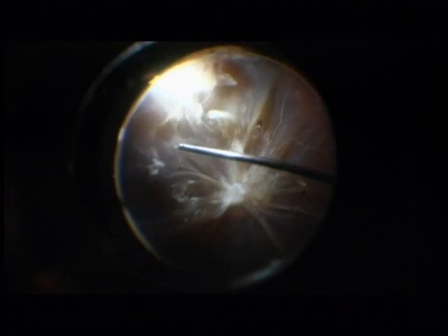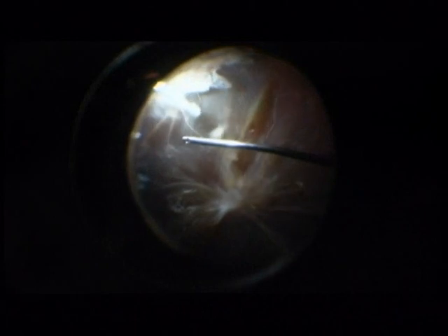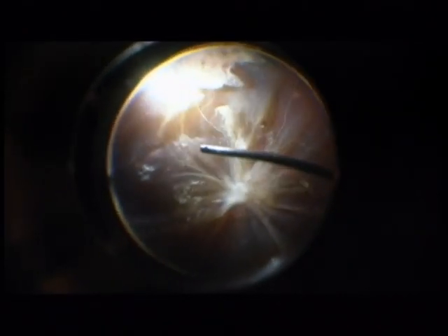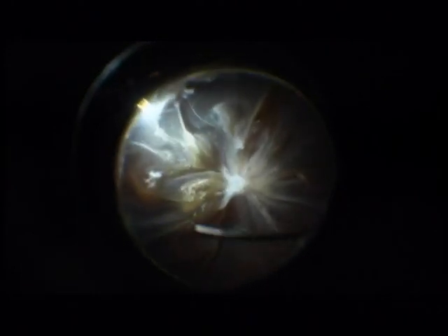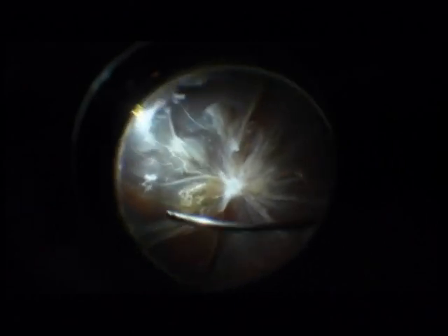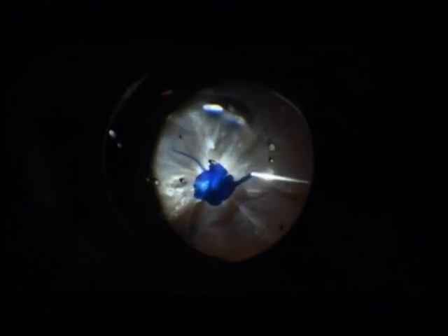I'm detaching the posterior hyaloid to be sure that I will not injure the retina. I continue with the posterior hyaloid rexis. At the nasal part, the perivitreal tissue is attached and here a rexis is not possible. This is typical for the nasal side.